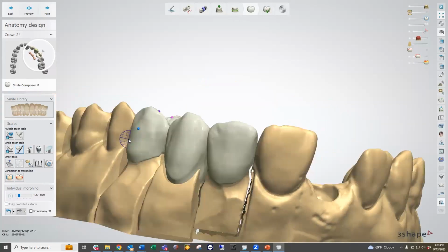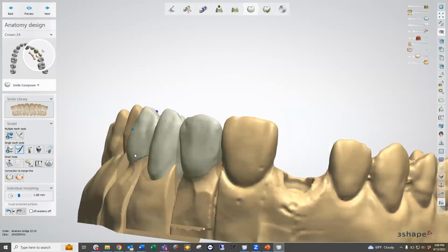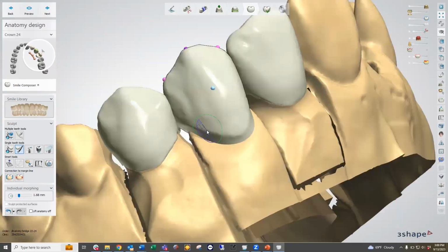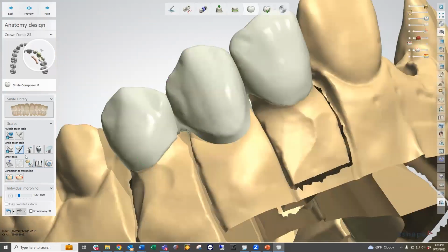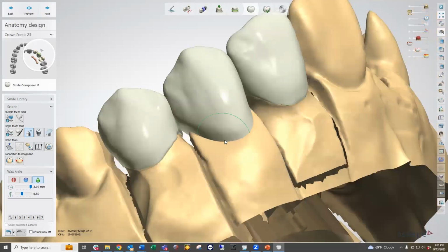So I might bulk this out a little bit more. Okay, looks good. We can see that the pontic is still sitting a little bit flat. Actually, first I'm going to use the smooth tool to smooth up this ridge that we see along the side here, so it looks a little bit more natural as it curves into that ridge.